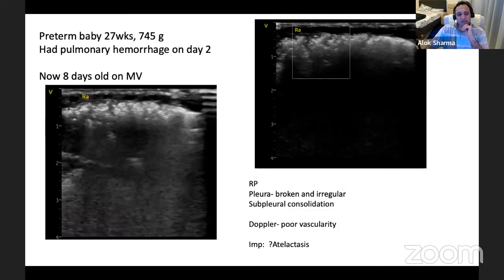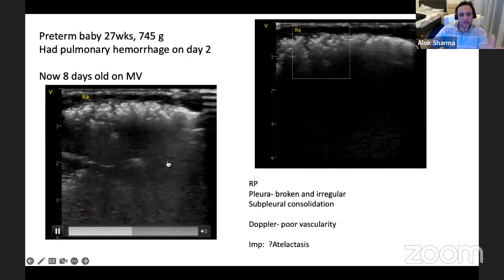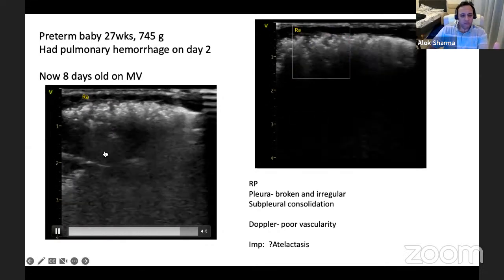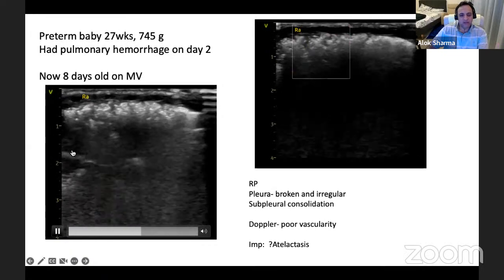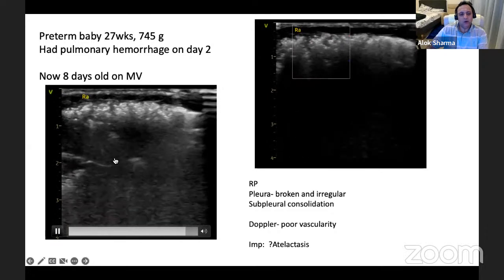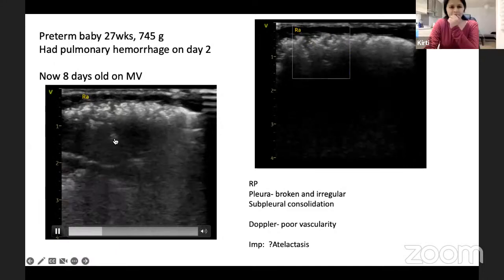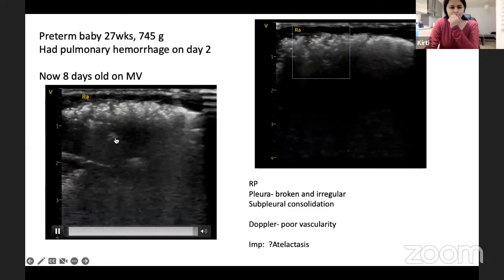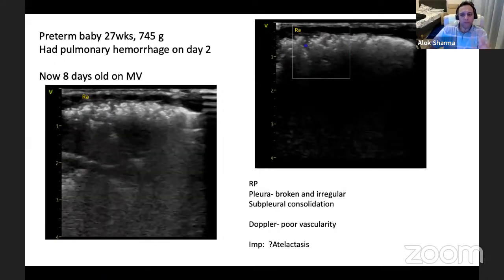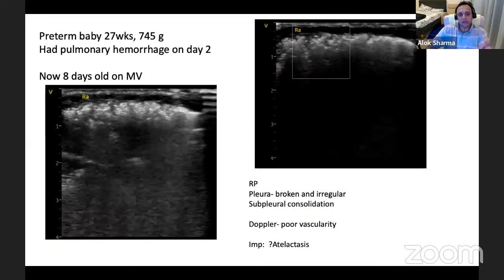And as you come distally, just below, if you take your arrow, we're taking the image on the left side. Just move to your left. Stop there. Go back to where you were. A little bit more. Now go up. Now there's a small dense white area in between. Can you see that? Yeah. So that's consolidation. It could be atelectasis, it could be consolidation, and we'll talk a lot about this when we do pneumonia, collapse, and consolidation.